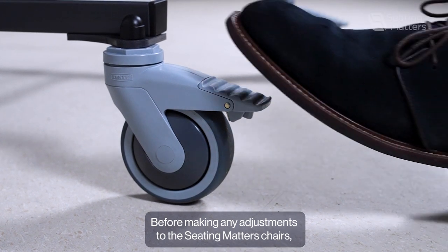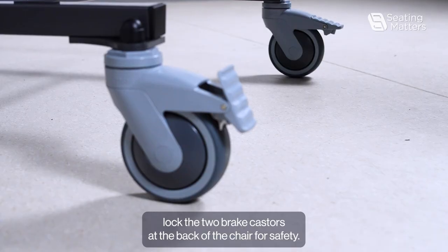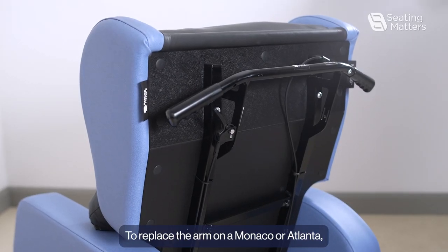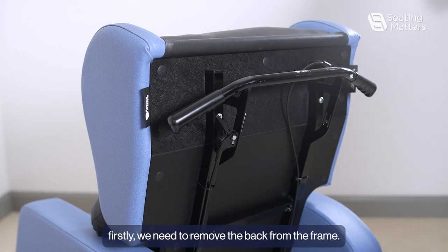Before making any adjustments to the Seating Matters chairs, lock the two brake casters at the back of the chair for safety. To replace the arm on a Monaco or Atlanta, firstly we need to remove the back from the frame.